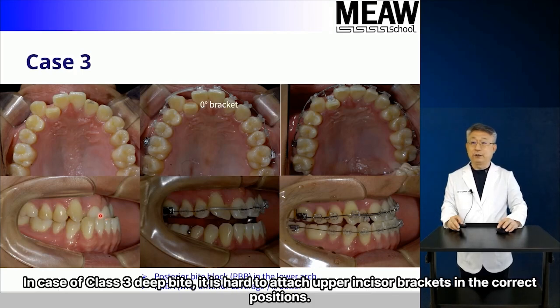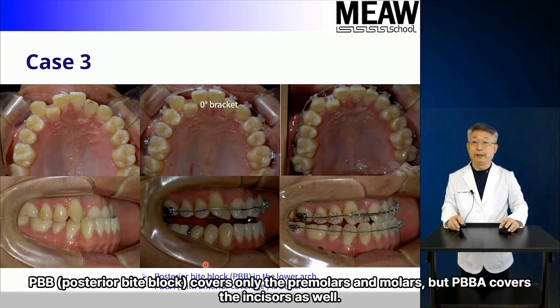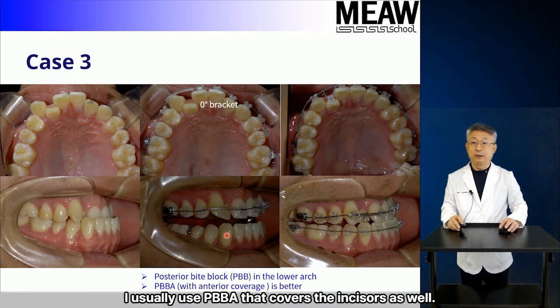In case of Class 3 deep bite, it is hard to attach upper incisor brackets in the correct positions. Therefore, I recommend the use of posterior bite block with anterior covering, PBBA, in case of Class 3 deep bite. PBB, posterior bite block, covers only the premolars and molars, but PBBA covers the incisors as well. I usually use PBBA that covers the incisors as well.